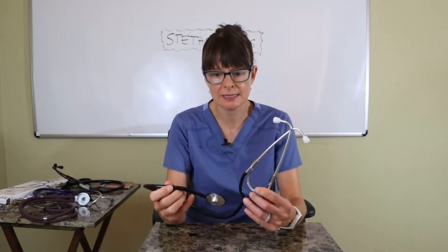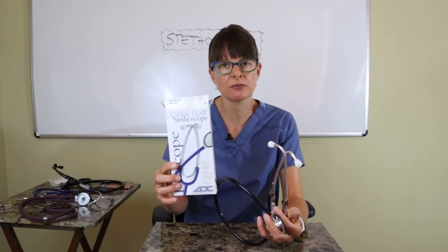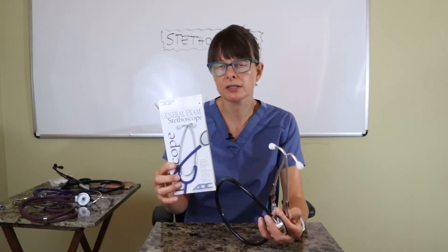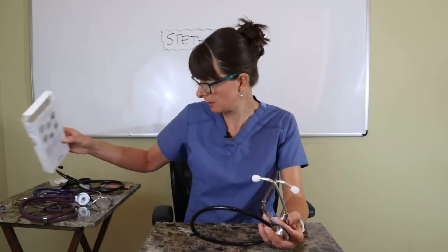Starting with this one — this is probably one of the least expensive stethoscopes. It comes in this box and is typically called a general exam stethoscope. This is one you'll often find in the clinical setting in an isolation room, where it stays in the room and is reused by providers and cleaned in between.